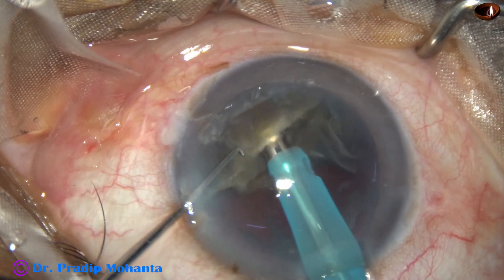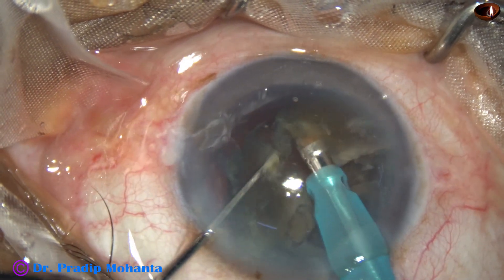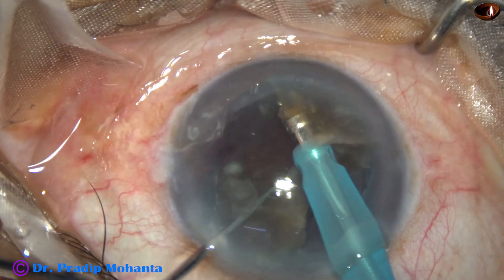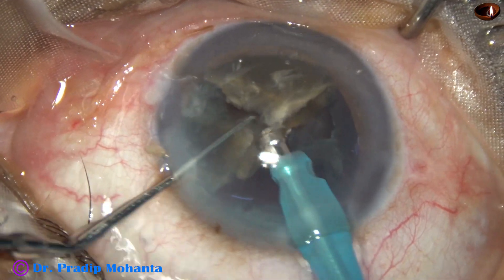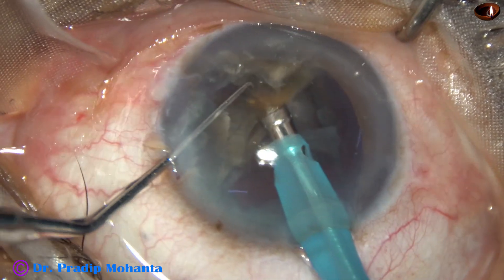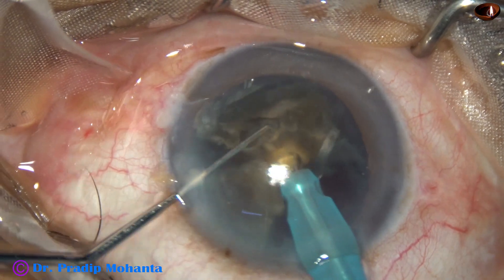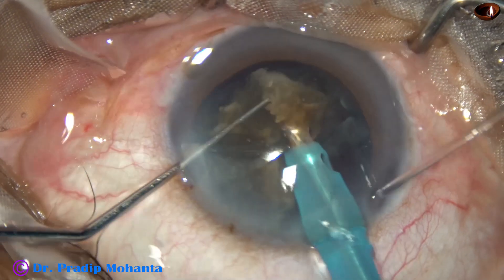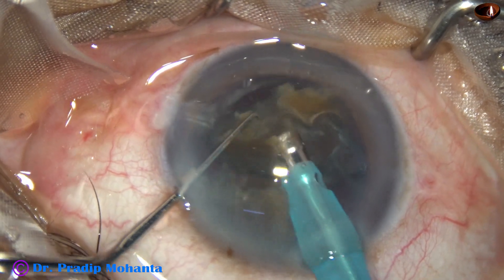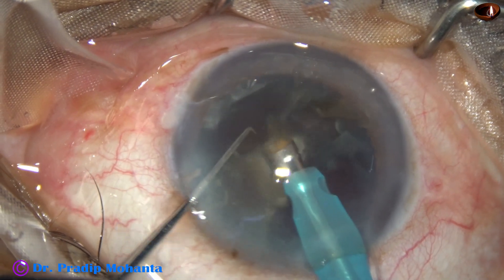The other hemi-nucleus is being divided in the same way. The tip goes through the substance of the hemi-nucleus and it is chopped. There is a small attachment at the central part and it is released by a short application of BSS at the band joining the two large fragments.